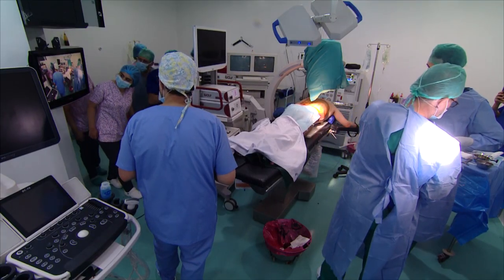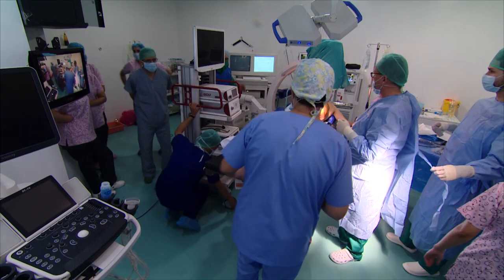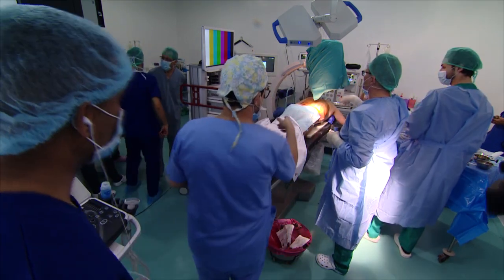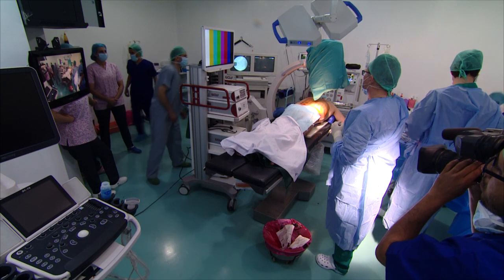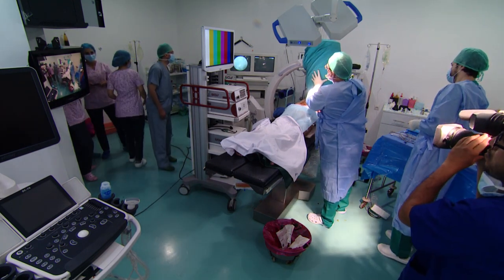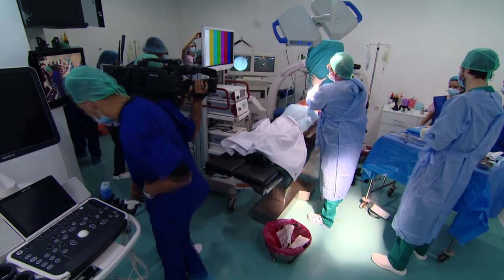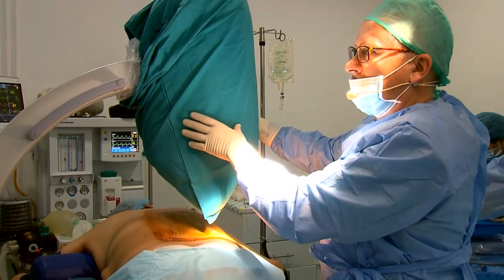The question is the position of the bolsters. Can you show them to us better? The mattress under the patient. Okay, I think it's okay. Now let's check, to show the position of the bolsters under the patient. Show. Okay, excellent.